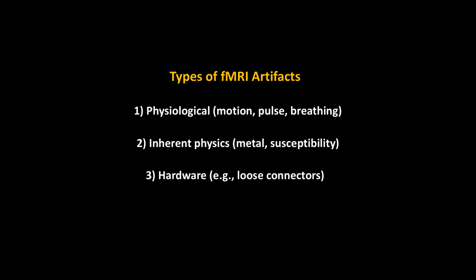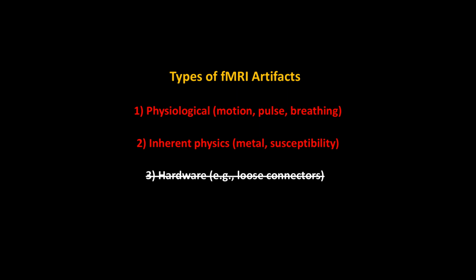The last one, hardware, again, maybe loose connectors, maybe something spiked in the equipment, and in that case, not a whole lot you can do about that. So what we're going to focus on the most about training are these first two, which are physiological and also inherent physics.